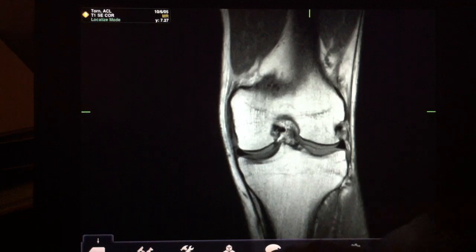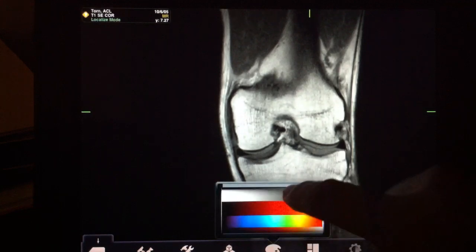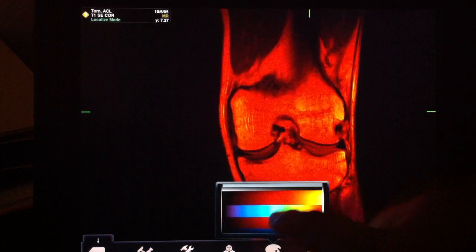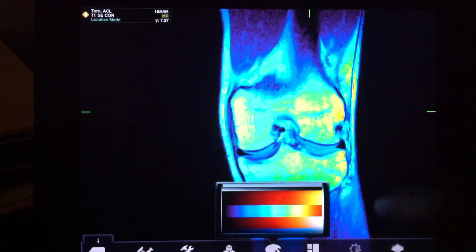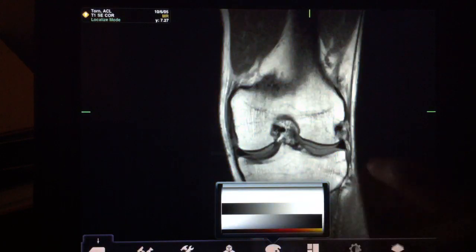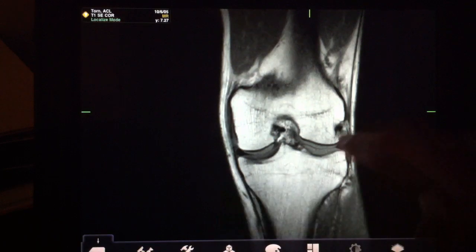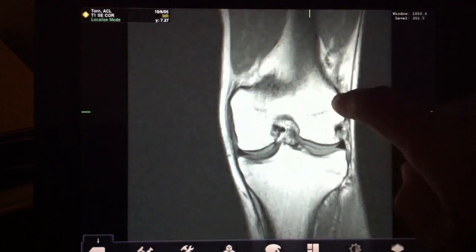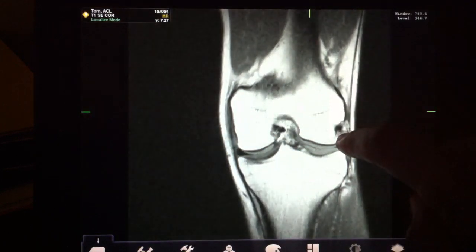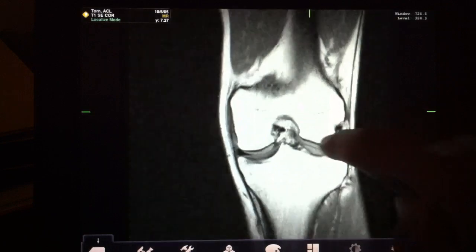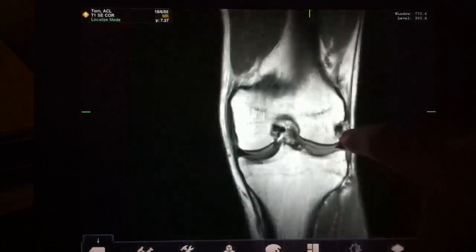You can change the color panel through here, so you can have a color lookup table of your own. The windowing is simply changed by dragging your finger up and down. You can see the numbers, though they're kind of small, in the top right-hand corner for the window level.